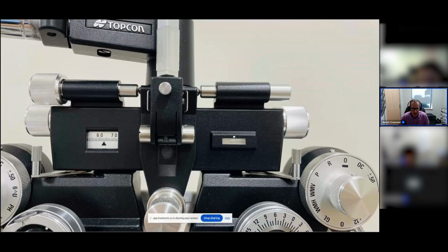The knob on the left side of your picture, on the lower part, is used to change the interpupillary distance. So you're going to want to rotate that back and forth and make sure that the oculars are in front of the patient's pupils. You see that there are two silver levers going further down.